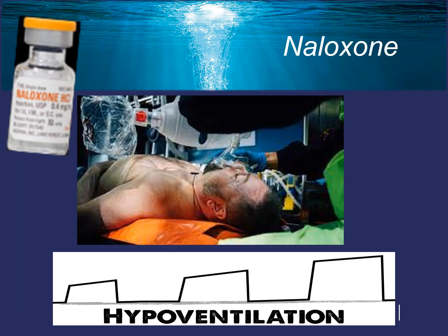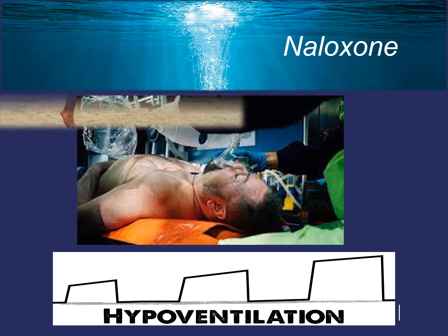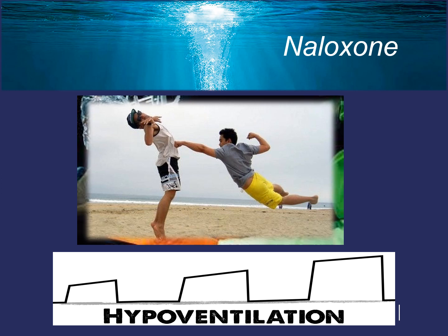So now let's talk about naloxone and capnography. By utilizing capnography monitoring during naloxone administration, we can effectively titrate the dose of Narcan or naloxone required to reestablish adequate effective ventilations and a respiratory rate. That's the goal of naloxone after all, right? Paramedics want to avoid total reversal of the opiate overdose due to the threat of the patient experiencing withdrawal seizures, possible vomiting, and possibly the patient becoming combative or violent. We don't want them flying off the floor.